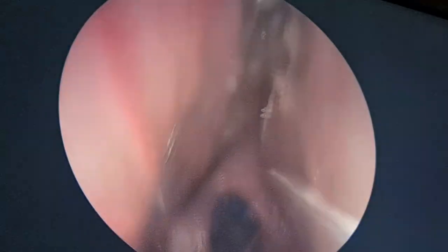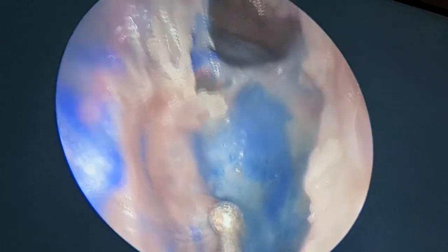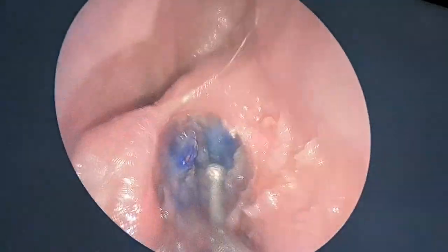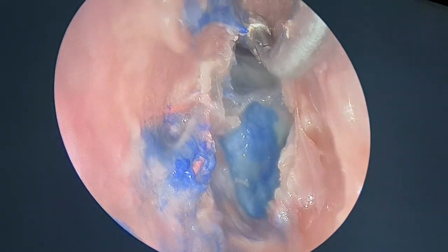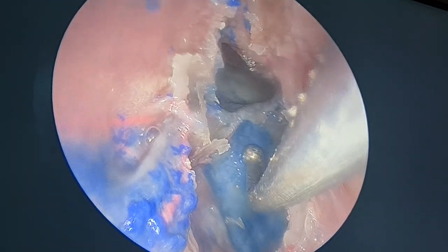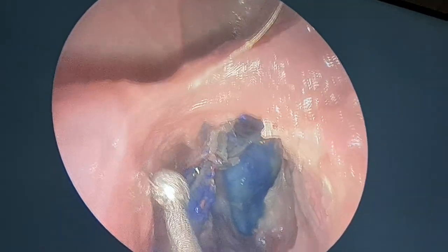So that is important. The more the pneumatization, the more careful you have to be with the anterior ethmoidal artery, as it can be running without a bony covering. So again, at this point, I have three things: the beak, the frontal sinus, the supraorbital recess, and the anterior ethmoidal artery.